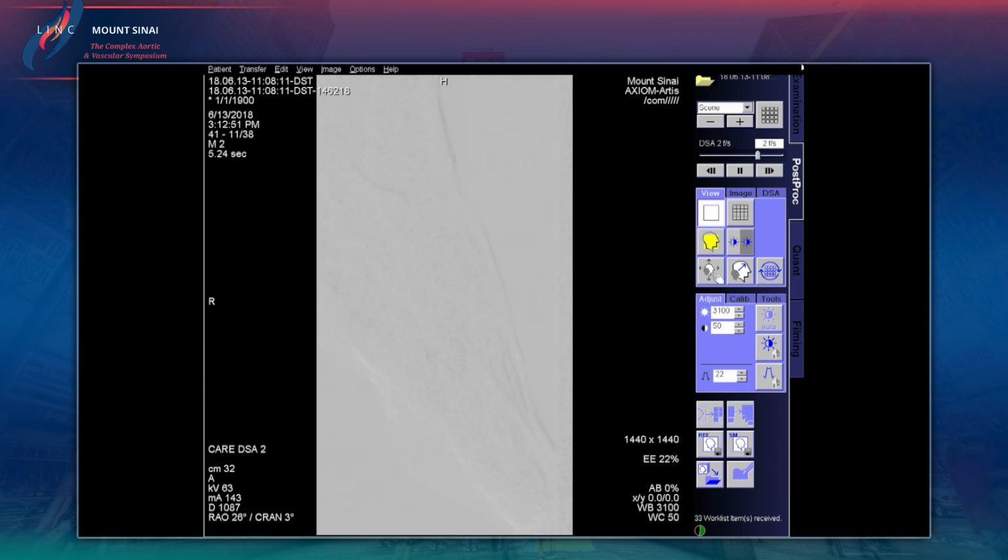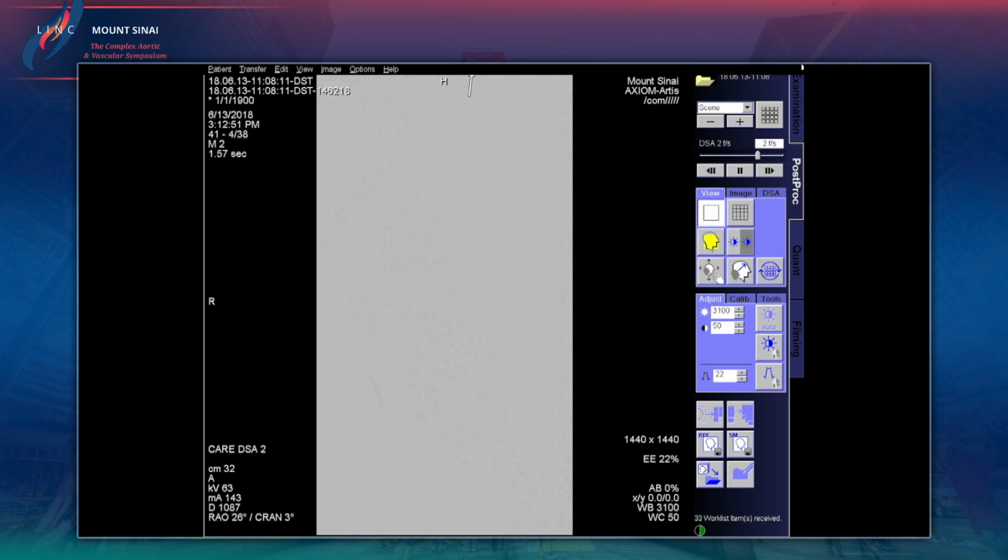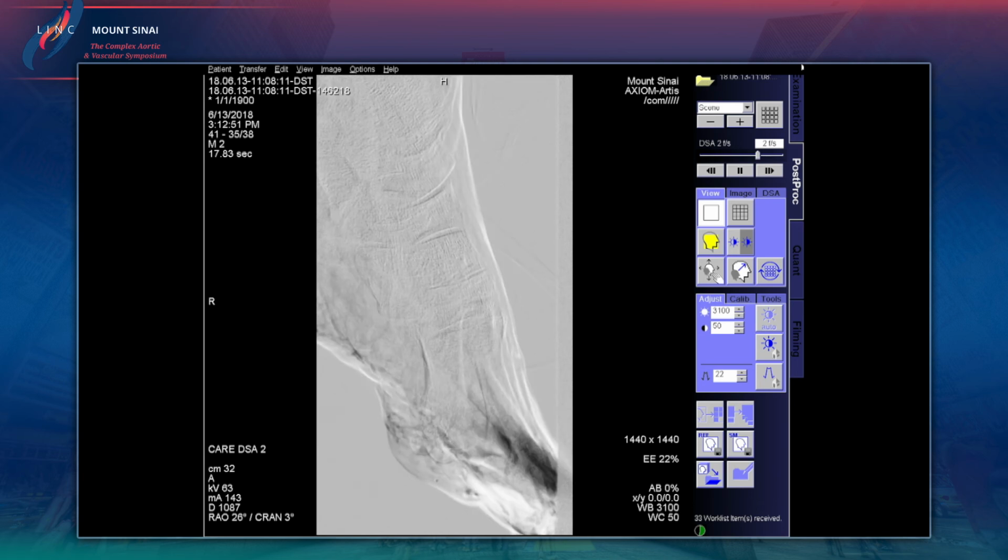Okay. Now I just wanted to show you the final picture. So this was the patient who basically had a non-healing ulcer of the foot and had the very calcified, occluded mid-anterior tibial artery all along here. So we got pedal access. We were able to cross from below using the Cook system. And through the foot, as you can see here, we'll cross in a second. Very difficult to get through. Stephen was there. We had to come with a wire from above, and then we were able to cross from below.